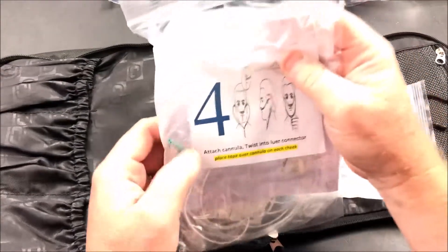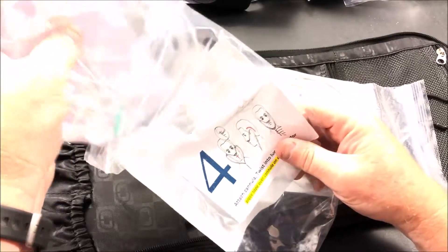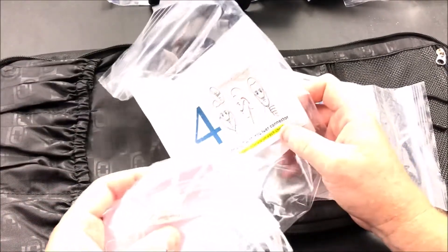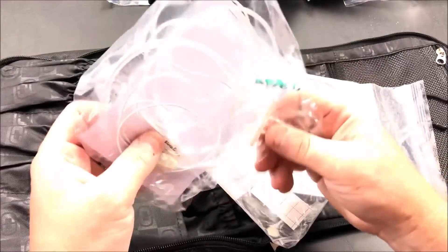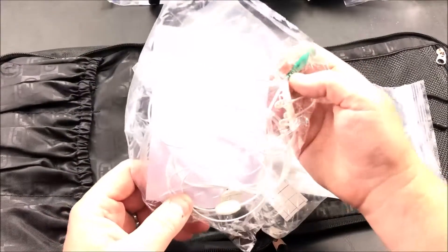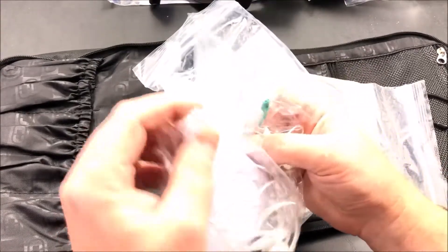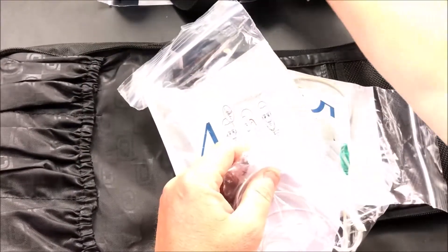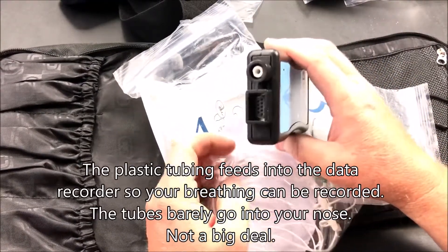Next up in bag number four we have what they call the cannula — it's like a nose thing. You put it around your nose; it has two little tubes, one goes in each nostril, and you kind of wrap it around your ears for some strain relief. You also use two pieces of tape on either side of your nose. It has a green connector, and the cannula itself screws into the top of the device with just a quarter or half turn — it threads into the top.